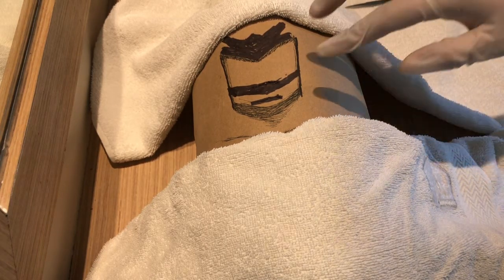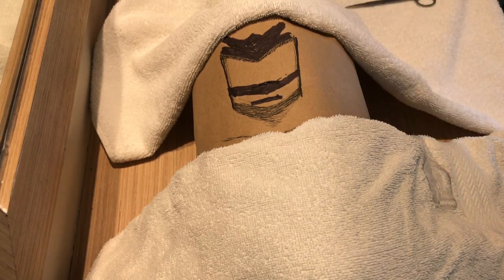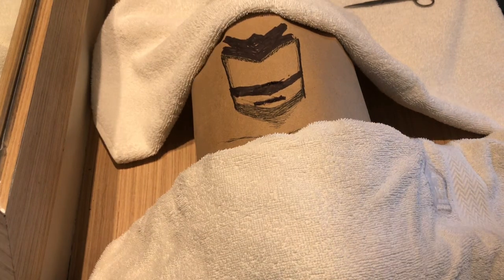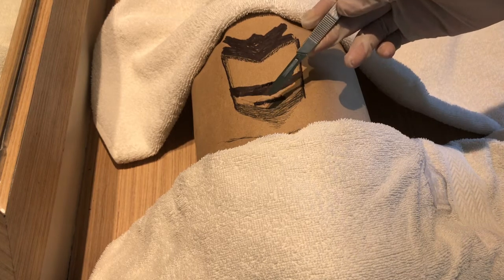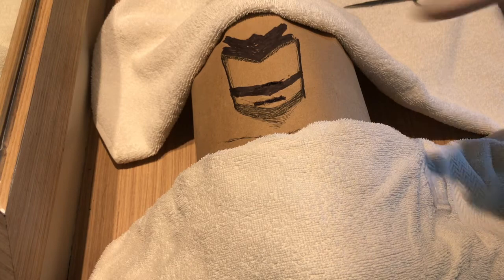The incision should be at the level below the first tracheal ring, or approximately 2 centimeters above the suprasternal notch. For demonstration purposes, we will use the line shown. The incision should be at the level below the first tracheal ring. So after planning the incision, make a horizontal skin incision 1 finger breadth below the cricoid prominence.